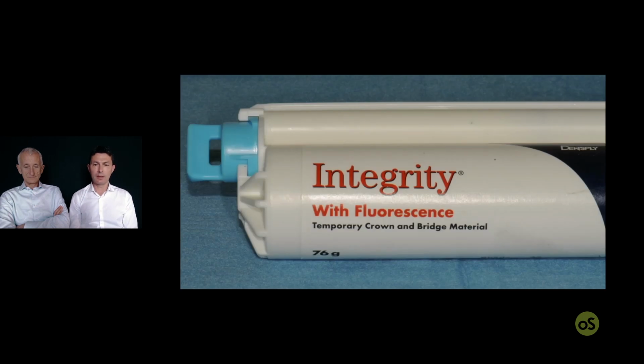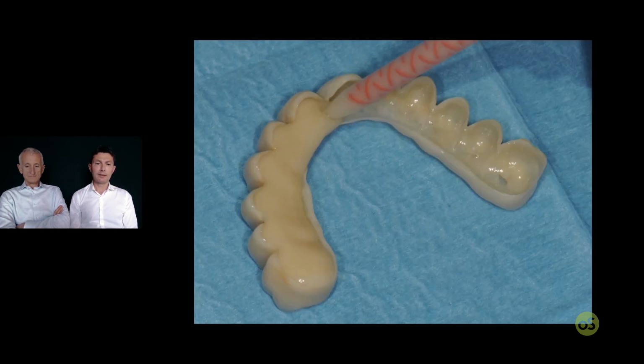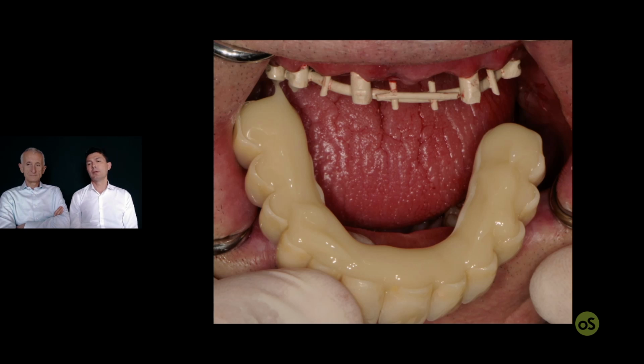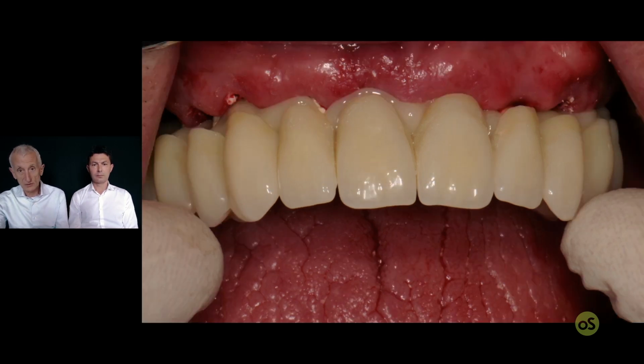Now select one reline material, like the diacrylate, and it's time to fill the shell completely, and now it's time to place it in the mouth. Okay, once I get this from Gianluca, I put it on the framework. There is nothing to try, because we have just done this try here, so no surprise now.